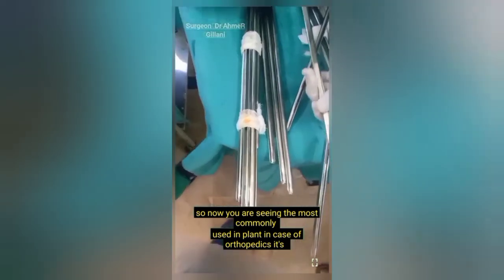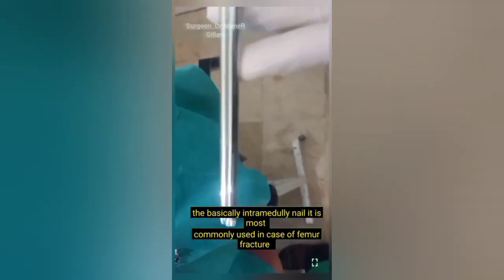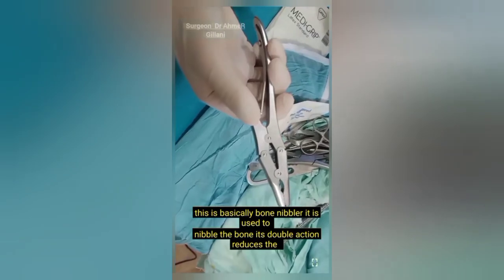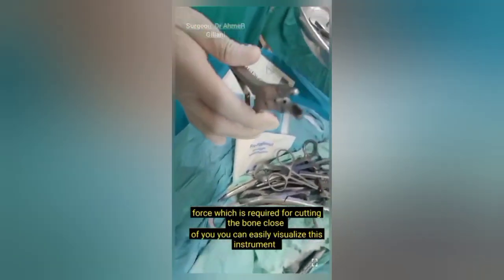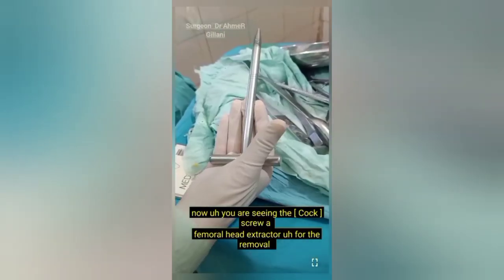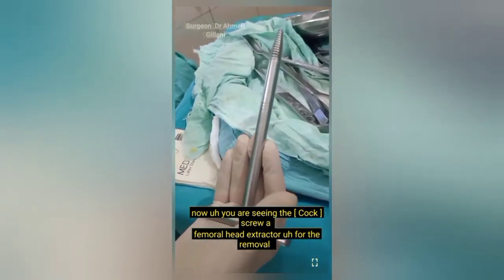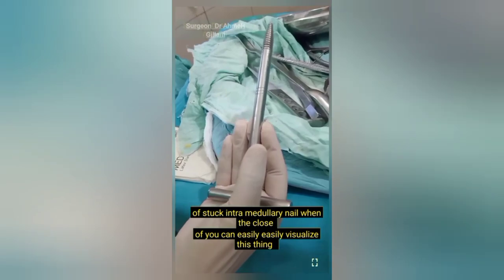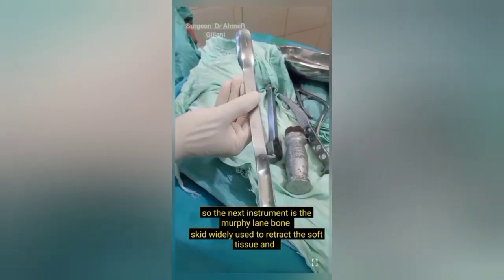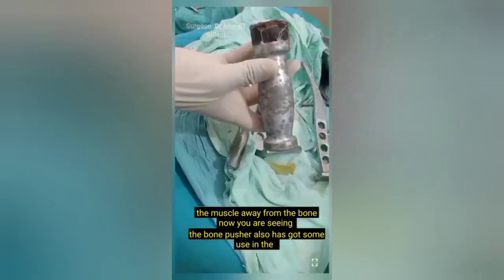Now you are seeing the most commonly used implant in orthopedics — the intramedullary nail, most commonly used in case of femur fracture, inserted into the intramedullary cavity. Next is basically the bone nibbler, used to nibble bone. Its double action reduces the force required for cutting bone. Then you are seeing the corkscrew femoral head extractor for the removal of a stuck intramedullary nail. The next instrument is the Murphy-Lane bone skid, widely used to retract soft tissue and muscle away from the bone.